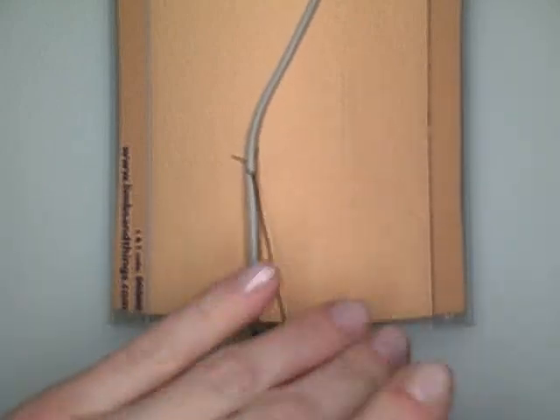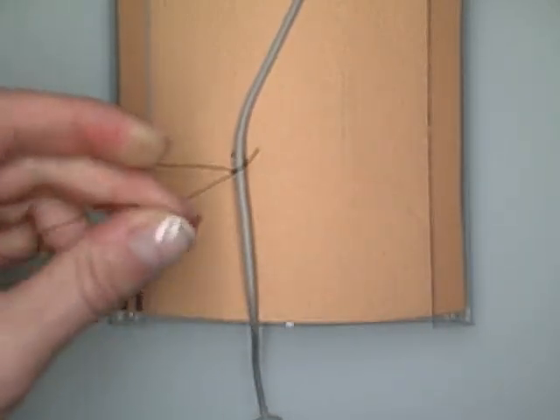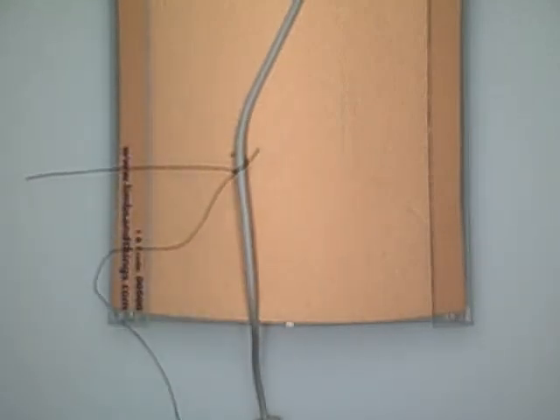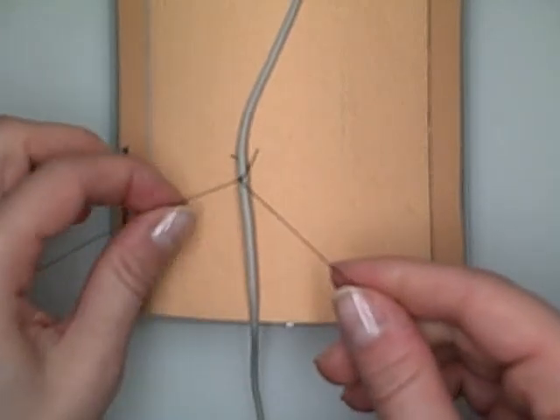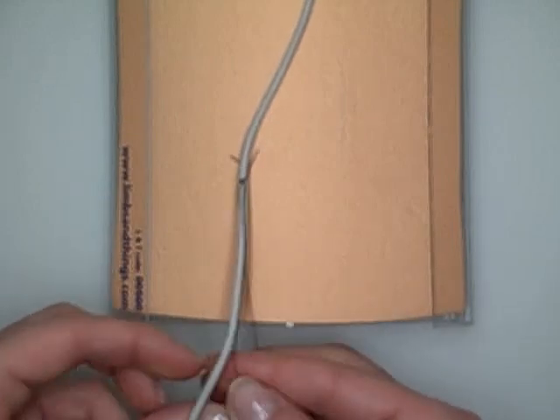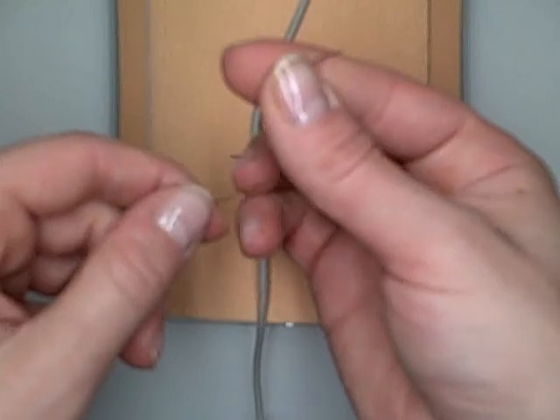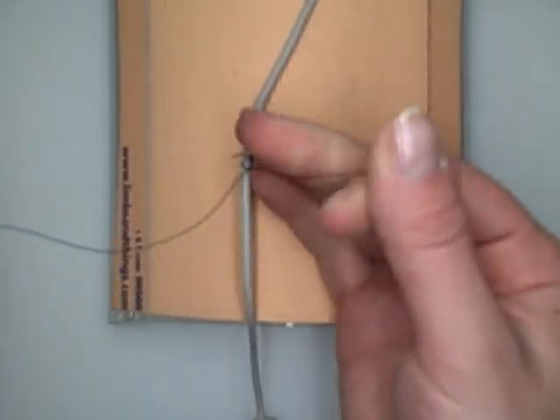Before I proceed, I'm actually going to cut off the needle so that I don't injure myself. And we're going to cross it underneath and tie just a few more knots here.